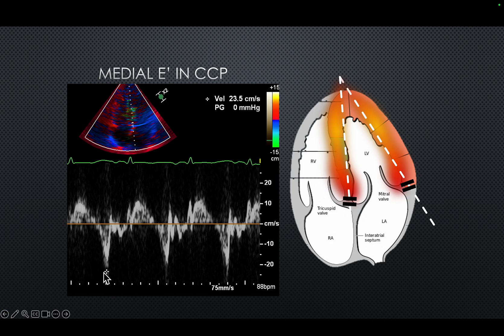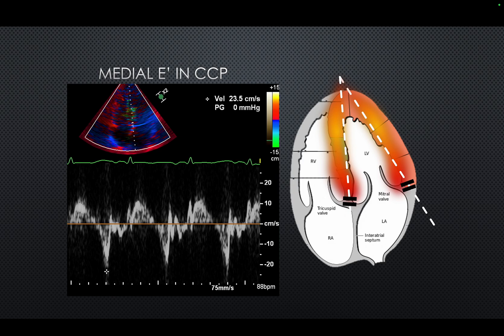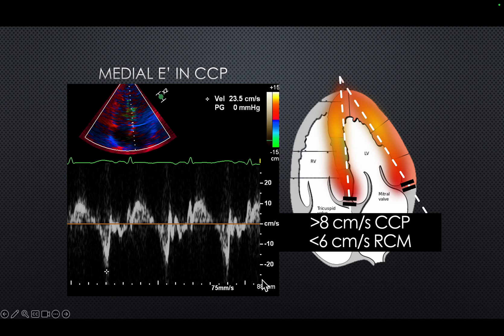Medial and lateral E' annulus velocities are markedly increased in CCP. In this patient the value was about 23. The medial E' in restrictive cardiomyopathy is lower because the muscle is weak — E' represents muscular movement or muscle strength. An E' more than 8 cm/s favors constrictive pericarditis, while less than 6 cm/s actually indicates restrictive cardiomyopathy, with very high sensitivity and specificity.